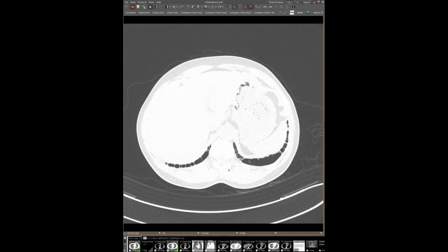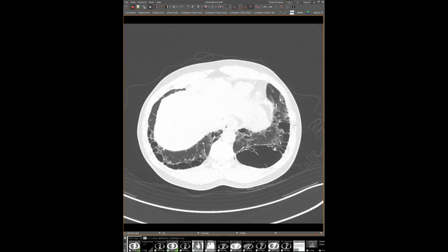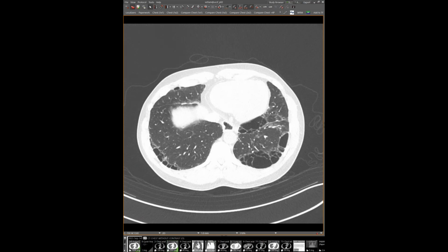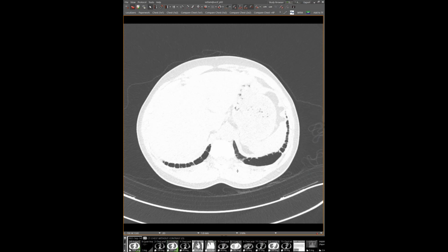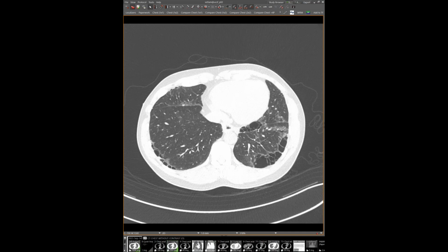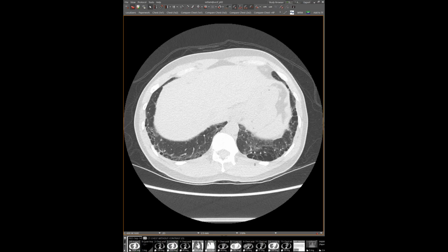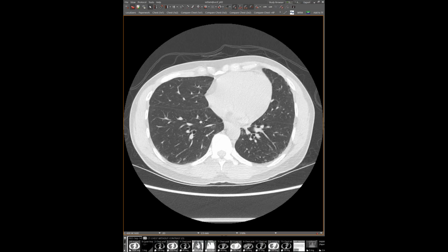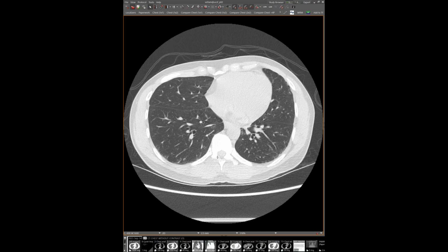as other histologic patterns. So Maya, I've not heard the term fibrotic DIP because when you first started showing this, I wondered if this was this airspace expansion with fibrosis that we see in smokers, where you get emphysema colliding with fibrosis. You get these thick-walled cystic spaces, not necessarily like on your first scan, more posterior, in the lower lobes. So yeah, I'd love to see that paper they published on because DIP is such a rare, somewhat controversial histology.